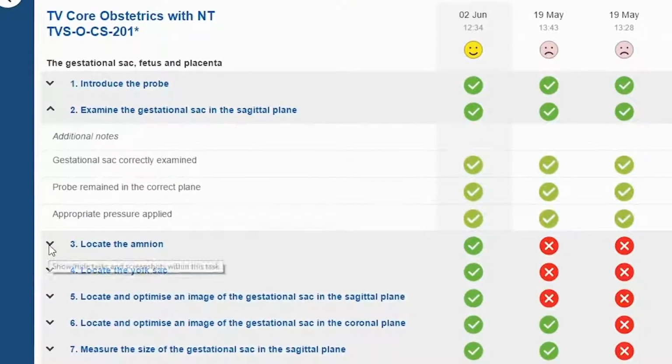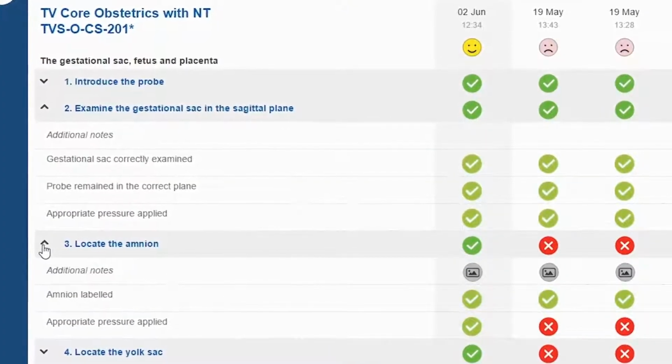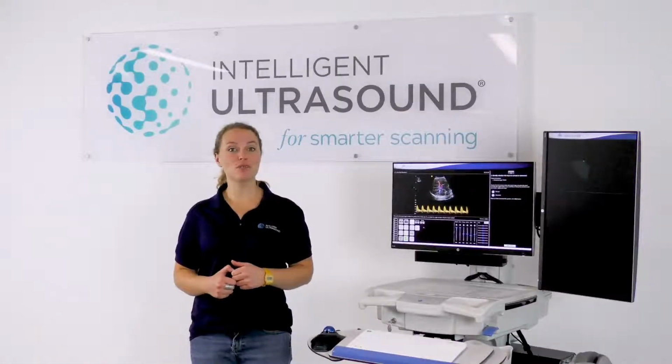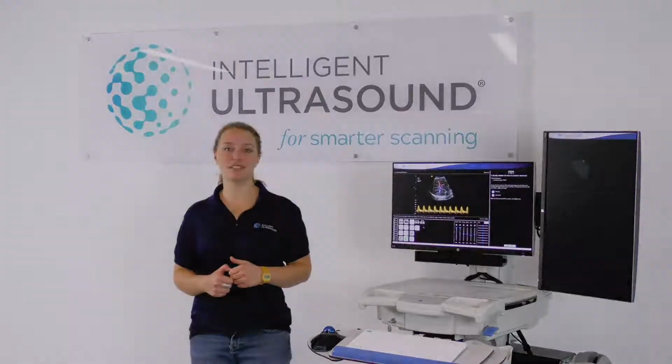ScanTrainer automatically marks performance based on our expert metrics, so trainees can self-learn in their own time at their own pace. Learn to scan with ScanTrainer, the most comprehensive and realistic ultrasound simulator.